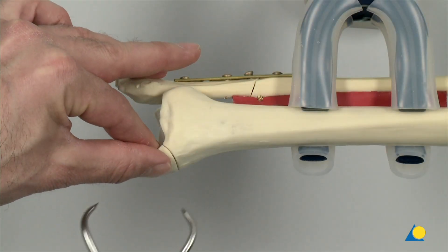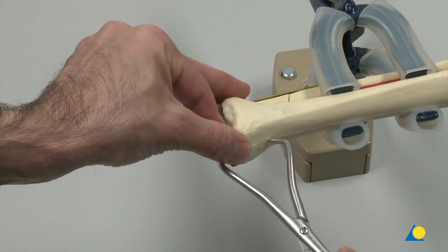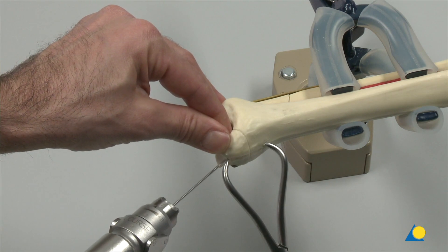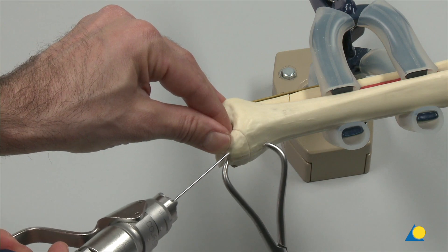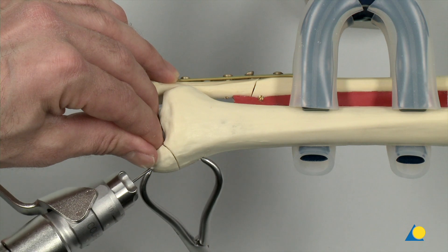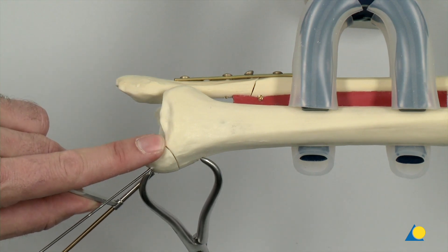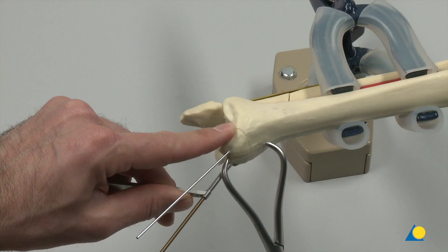The fracture is reduced anatomically using pointed reduction forceps. A 1.6 mm K wire is inserted to secure the preliminary fixation. Take care to ensure that the K wire does not go through the joint. The 2.5 mm drill bit is used to drill a hole for the 4.0 mm cancellous bone screw, parallel to the set K wire.